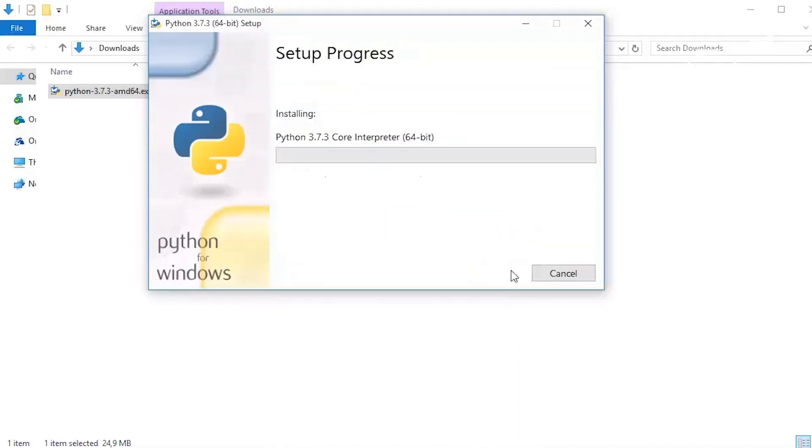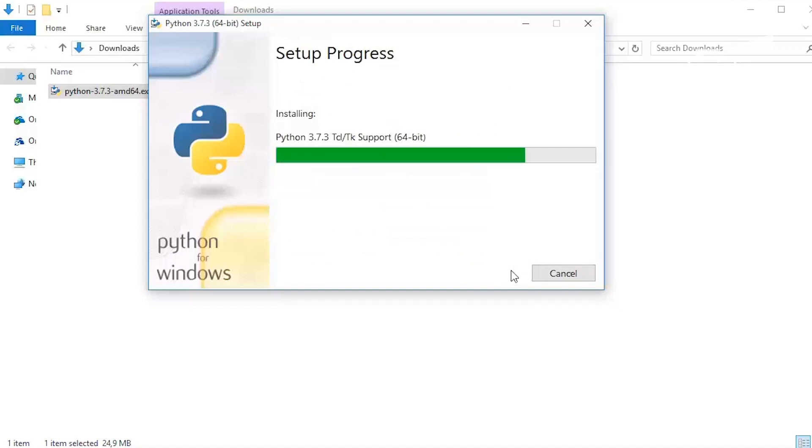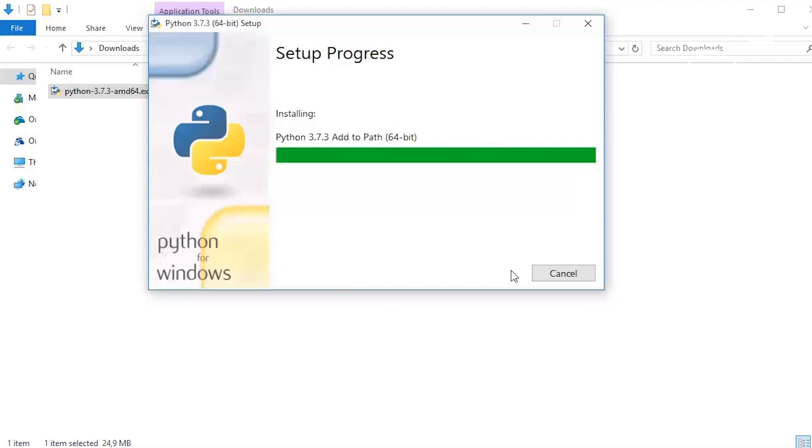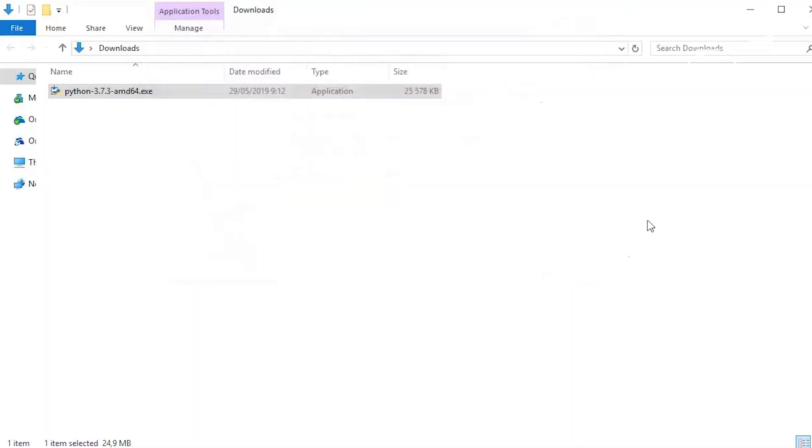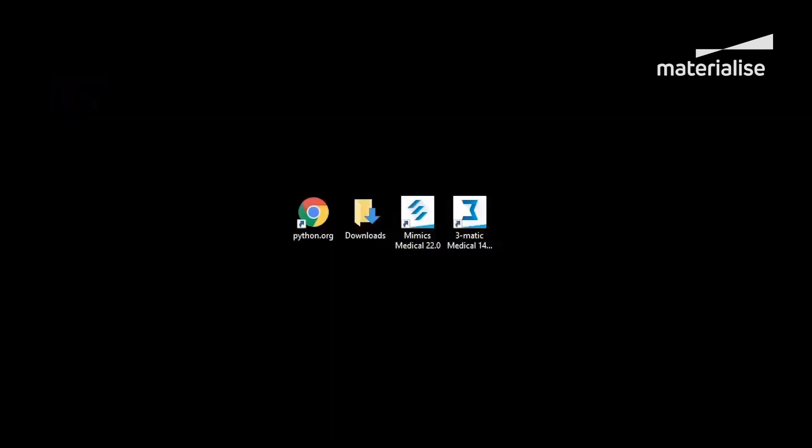After a successful installation, you can close the wizard and download location. After installing Python, we have to configure Materialize Mimics and Materialize 3-matic for scripting. I will start with setting up Materialize Mimics.